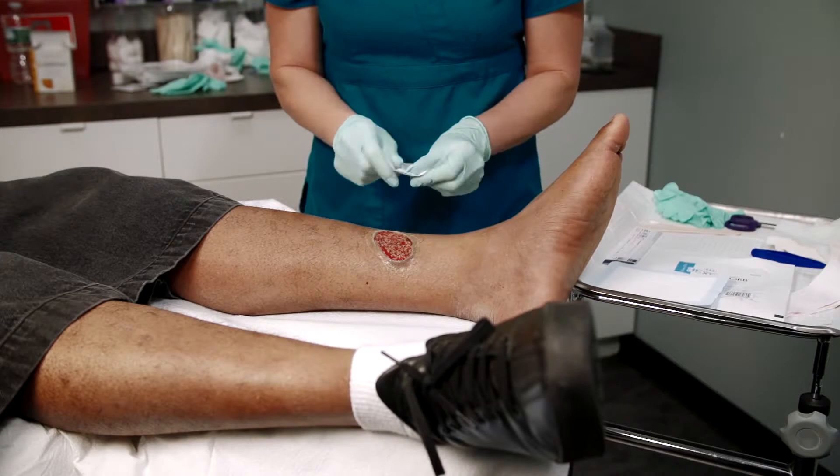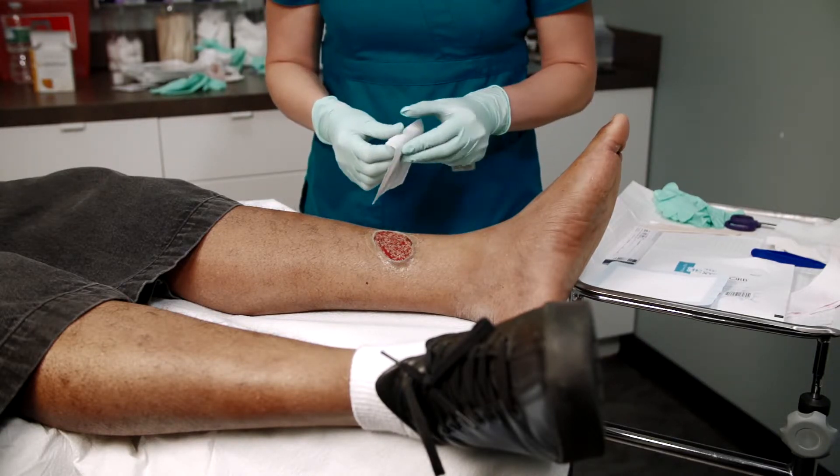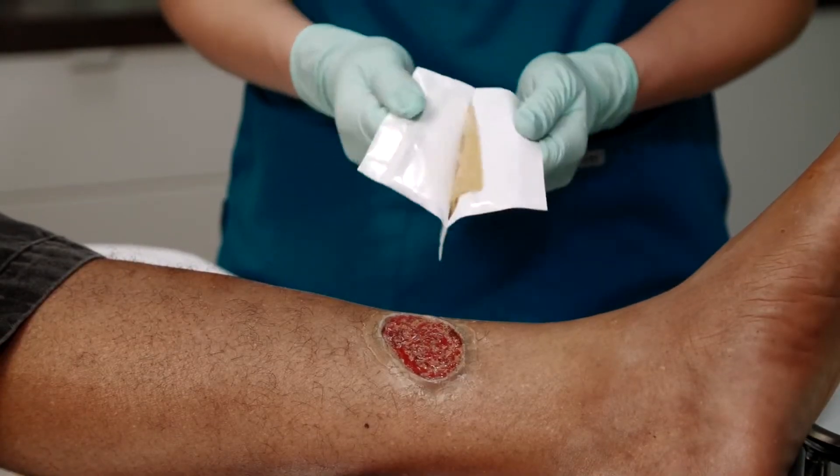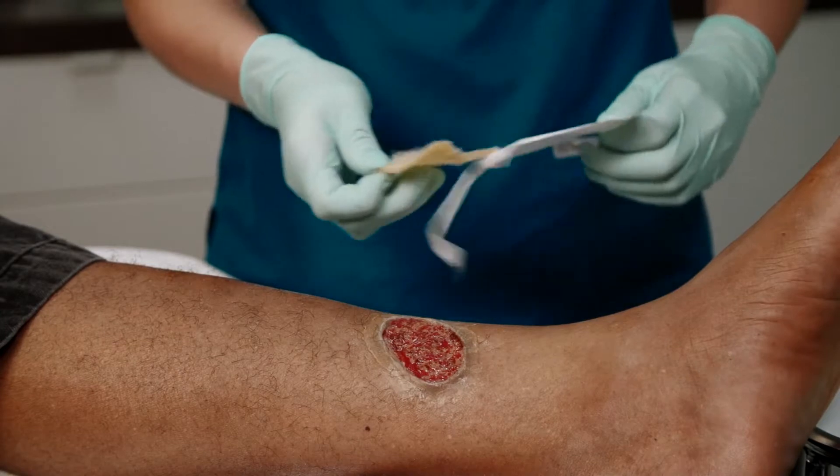Before opening the dressing, fold the dressing back and forth in both directions to make it soft and pliable. To open, firmly pull apart the two end flaps and remove the MetaHoney Calcium Alginate.